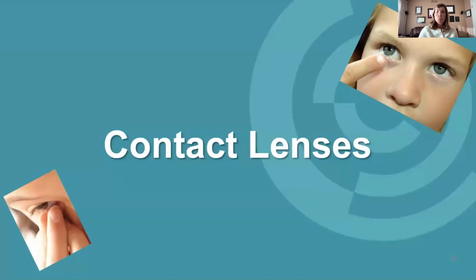Well, contact lenses, what options do we have? And again, children get on remarkably well with contact lenses. Certainly, when you look at the clinical studies that have been done, in most of the studies the children are either 7 or 8 when they start, that's the youngest age. And certainly my experience is that age can easily handle contact lenses with the appropriate, obviously, teaching and, of course, patience with them as they're learning the technique.